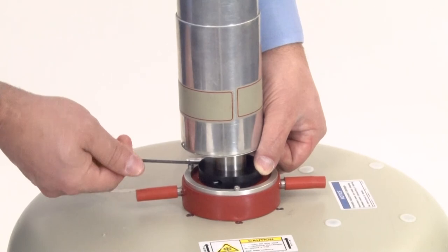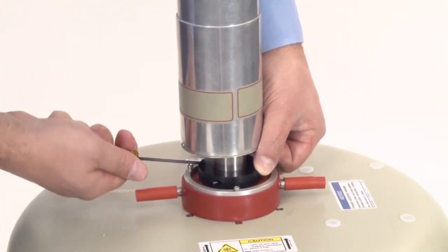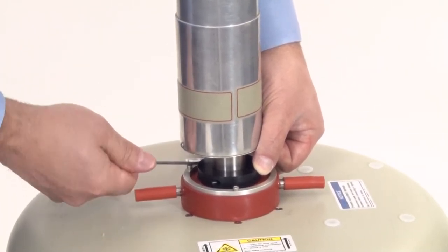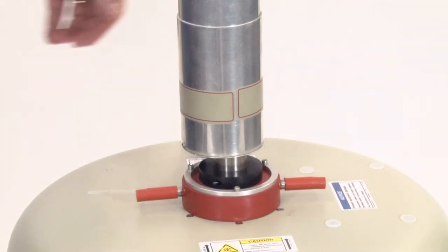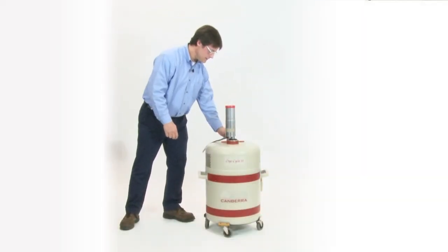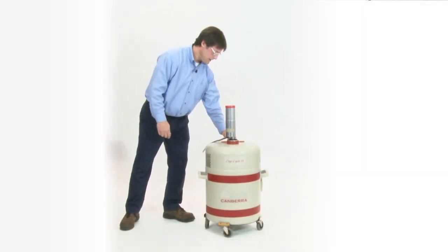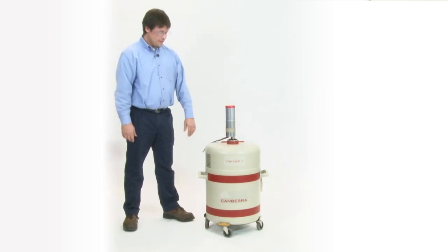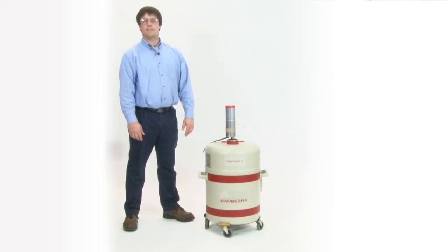The reason you take it off the bottom of the dewar is there's vibration associated with the cooler. And if the dipstick is touching the bottom of the dewar, the vibration will transfer to the dipstick and it might cause microphonics. So last thing you need to do is plug your vent plug back in. So there we have it, a fully installed collar and dipstick.